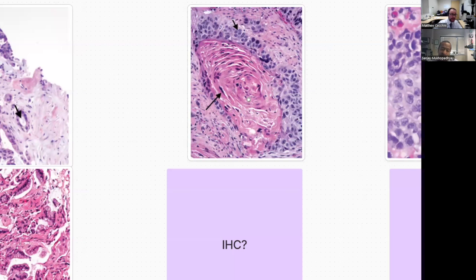Yeah, I agree with you, and I just wanted to say I think the CISH for HPV is actually better than P16, because P16 is non-specific and you can get it in other scenarios, including a subset of non-HPV related cancers. So I just caution people with using P16 as a marker in this scenario. And as usual, Dr. Katzenstein was far ahead looking at this problem. She realized many years back.